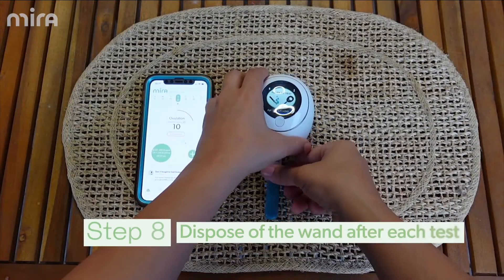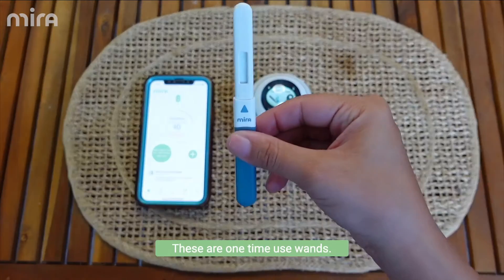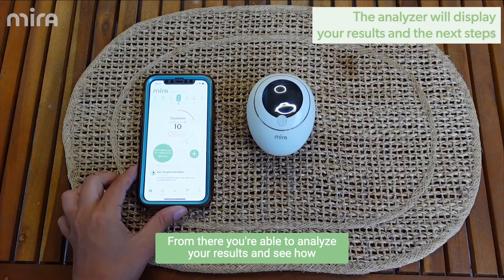Step eight, you'll go ahead and remove the wand and dispose of it. These are one-time use wands. From there, you're able to analyze your results and see how to move forward. Happy testing!